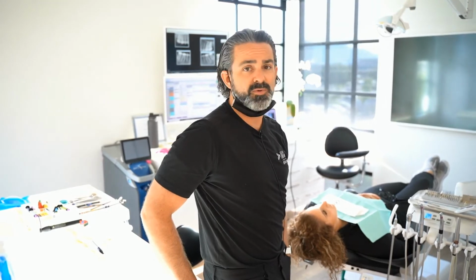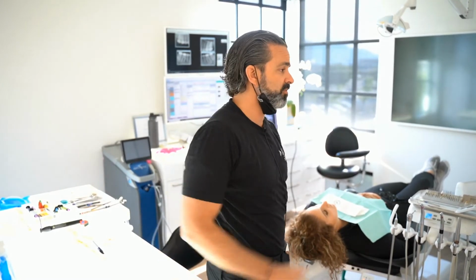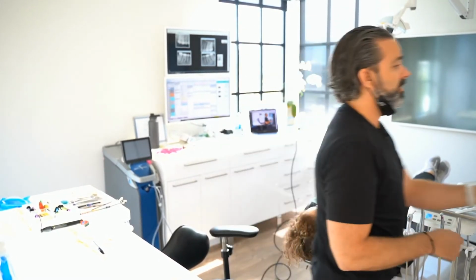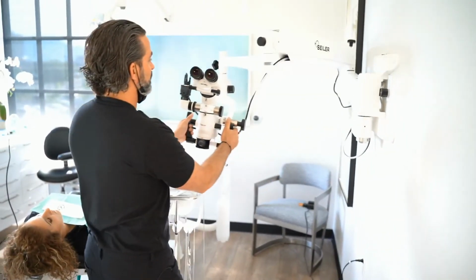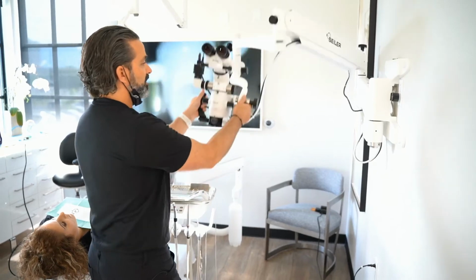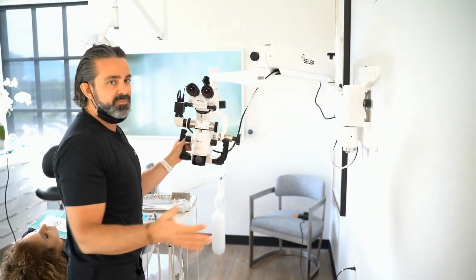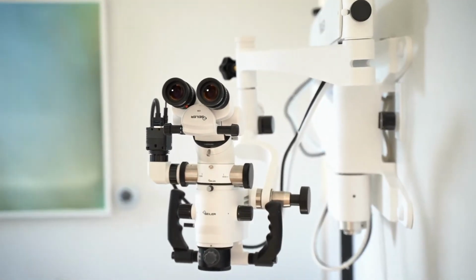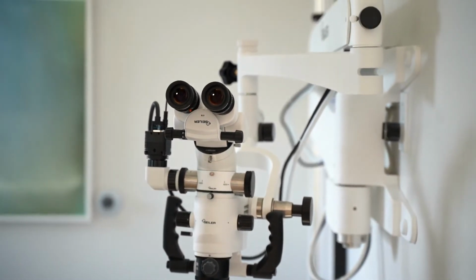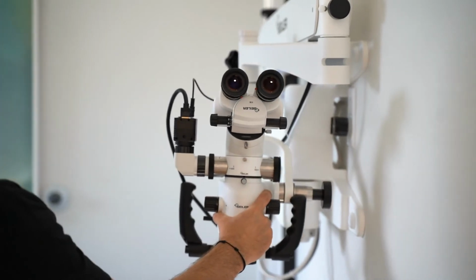Once you get comfortable with how to focus and you get comfortable with positioning, you want an arm that articulates very well, and you want an arm that, when it's there, it's there. It doesn't go up, stop, and drift. They can all be balanced out, but there are certain arms that balance out better than others. So that's another selling point for this company.